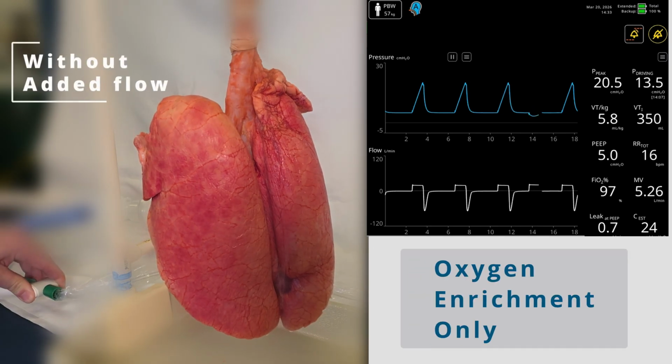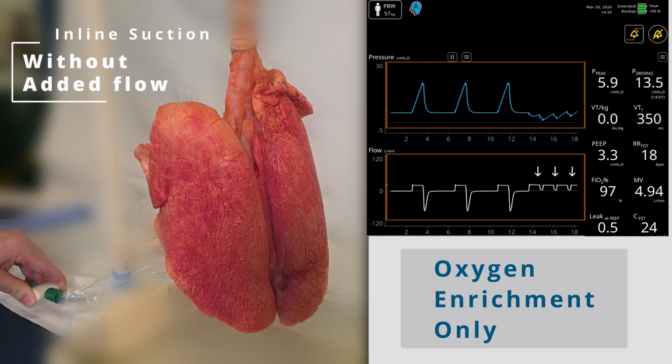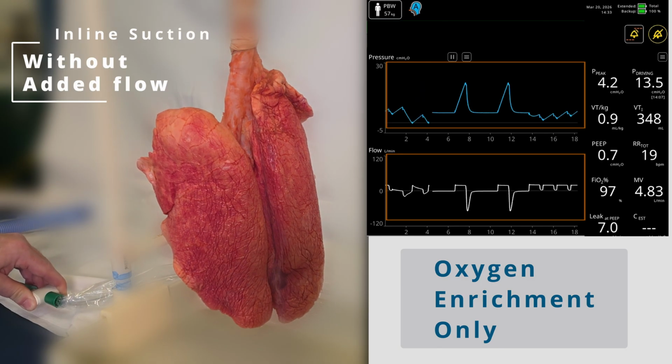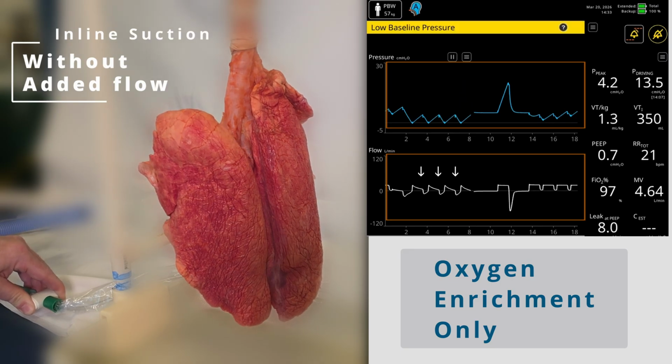As suction is activated, you're able to see that the lungs start to collapse throughout the suctioning procedure. You can see that the lung is no longer fully expanded.